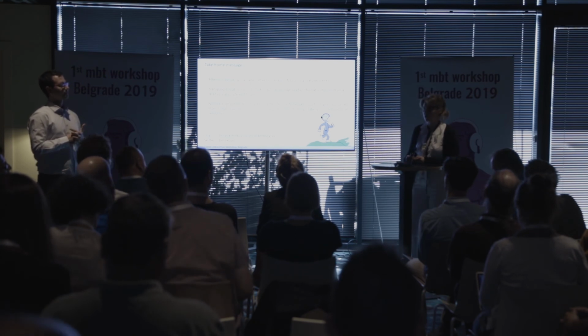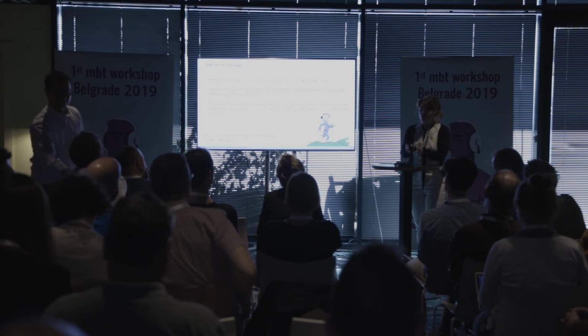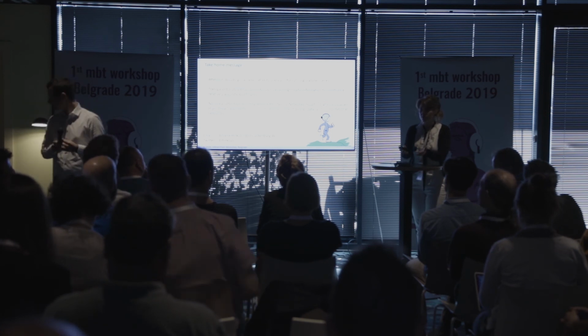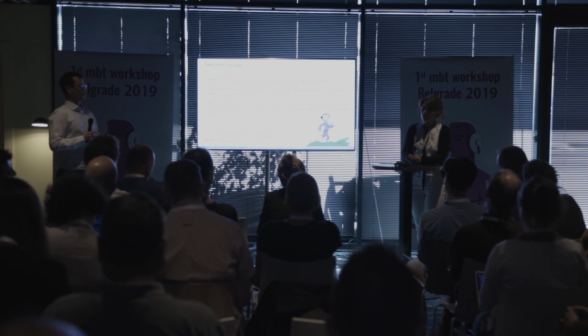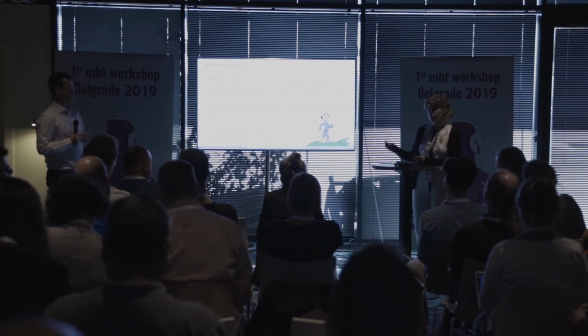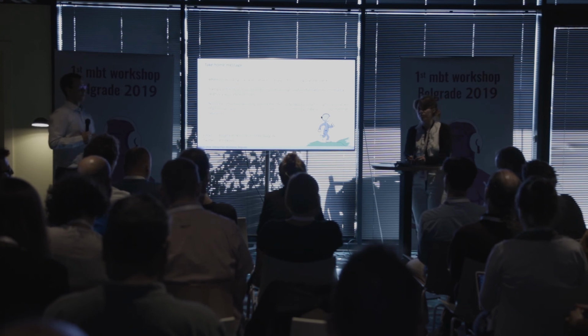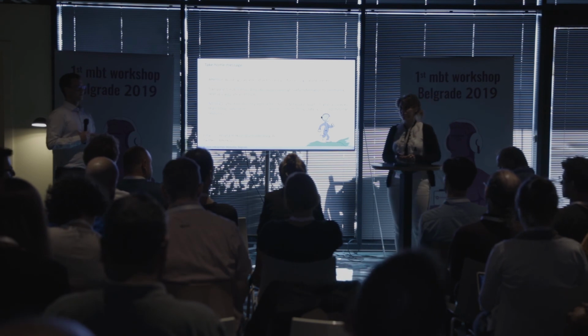It's not crucial though, because we have done speech decoding from 2 speakers presented from the same direction. So it's really more about the oscillation in speech than the spatial information, although the spatial information is a part of it also. Especially if you're doing decoding with neural networks, then it can sometimes really find the spatial component.